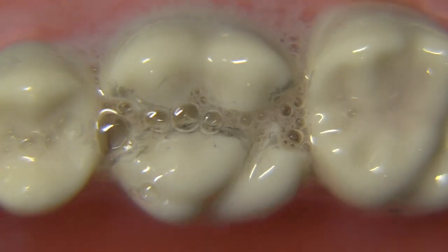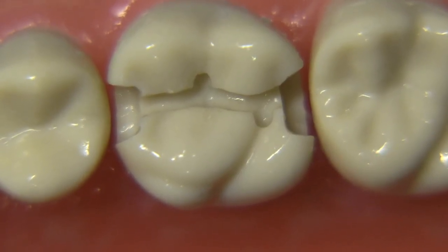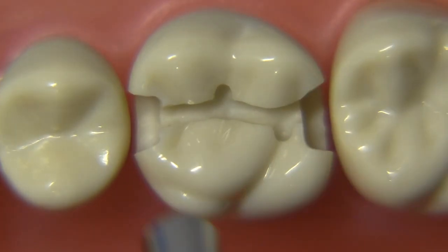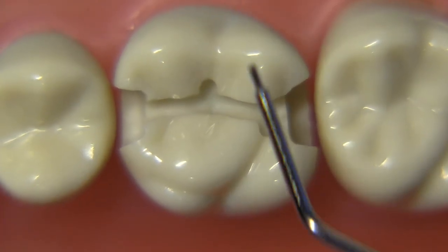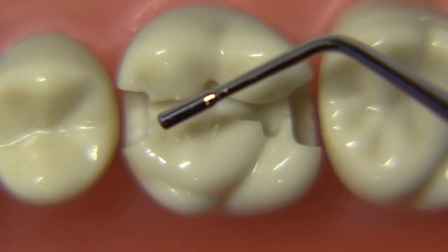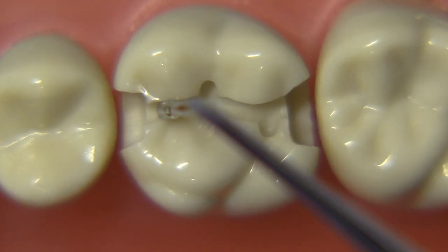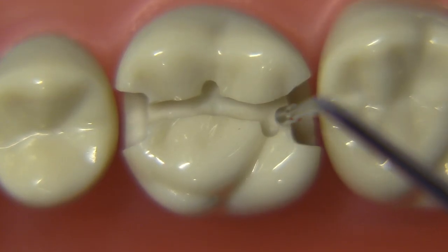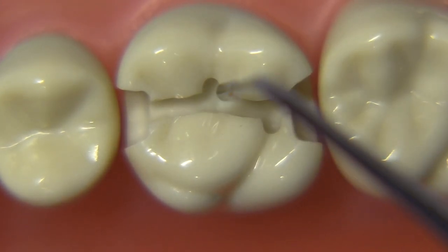Let's take a minute to clean off the tooth — you can use a little Windex and a toothbrush on the typodont; in the patient's mouth we'd use water and air spray. We have decent boxes, the pulpal depth looks good, and the extensions into the grooves look pretty good, maybe a little tight in the distal lingual. The outline form is still a bit inadequate and the isthmus is a little narrow, so those are things we'll address. The RGS3 is used here to measure the axial depth, and we can see a slightly sharp edge that we want to round off.